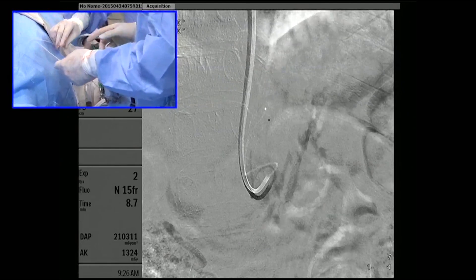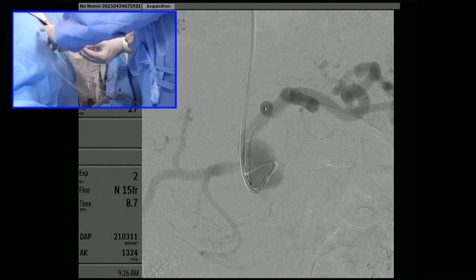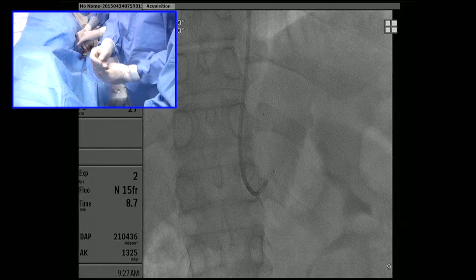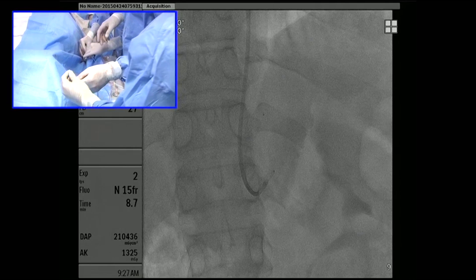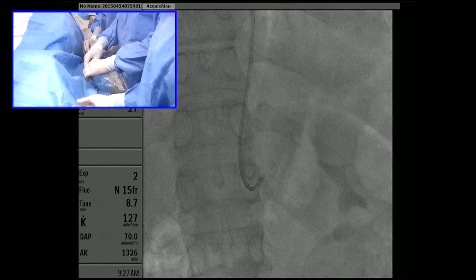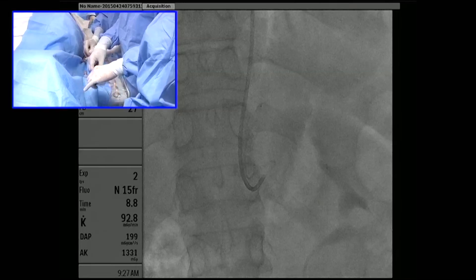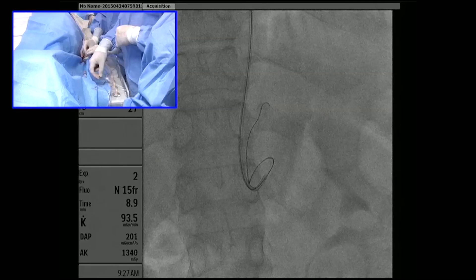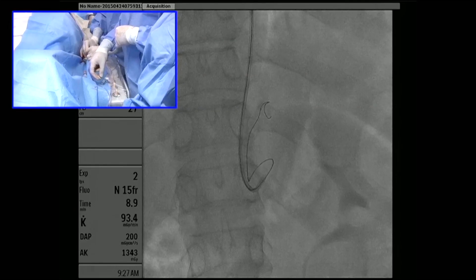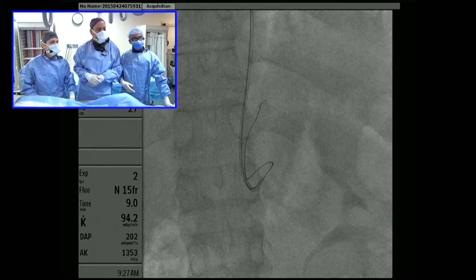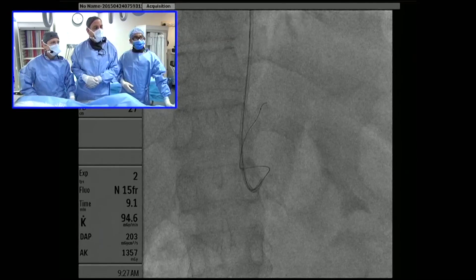What we've chosen here is a 018 detachable coil. Before we got started with the case, we were able to measure the splenic artery, which measured about 8 or 9 millimeters in diameter. We'll be fairly aggressive with oversizing these coils, especially when we want them to really seed in. Anyone who does embolization will tell you with a high degree of certainty that the most important coils are the first coil and the last coil.